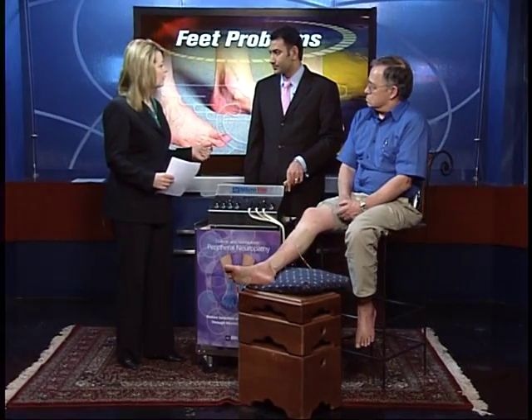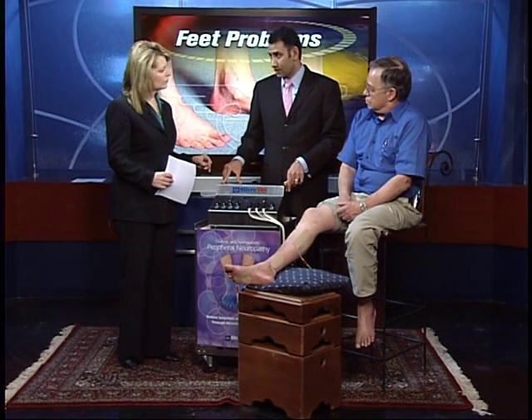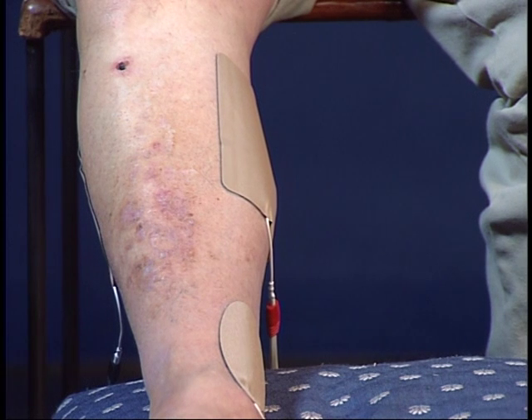How soon should a wound heal before you're worried? Depending on the size — if it's just a cut or a scrape, it should be a few days. If it's a larger cut, it may take a week. If it takes longer than a week, you should certainly contact your physician or podiatrist. The patients usually get two to three treatments a week, lasting about 40 to 45 minutes. They tell us after the third or fourth session that they're feeling less pain and better circulation. A lot of the swelling goes down because the muscles are pumping and it gets rid of edema.